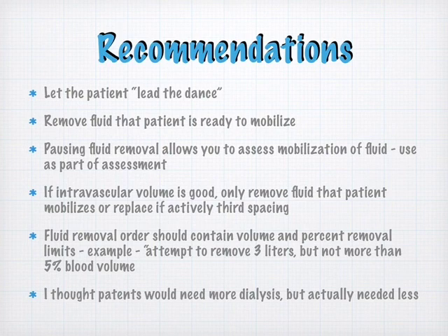So I've had patients I put on dialysis and I start removing fluid, and they start dropping fast. I know that person is not going to be giving me fluid. Not only are they not mobilizing their third spaced fluid, they might even be actively third spacing the fluid. So what's nice about that is it safeguards me. It tells me that I need to make a phone call to the physician and tell them that they're not moving the fluid, and then we can readjust that order to something that's more reasonable.